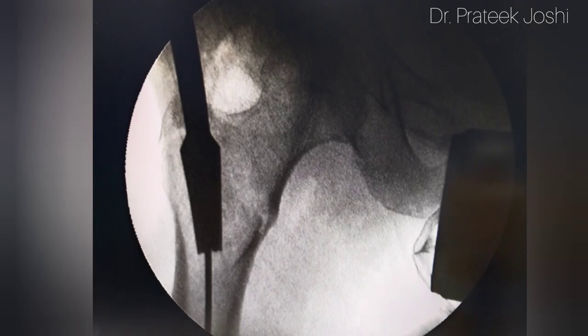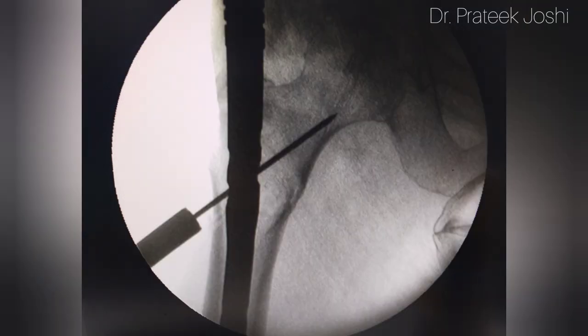Now we are going to do proximal reaming over the guide wire with the help of a cannulated reamer. We have inserted the nail over the guide wire.